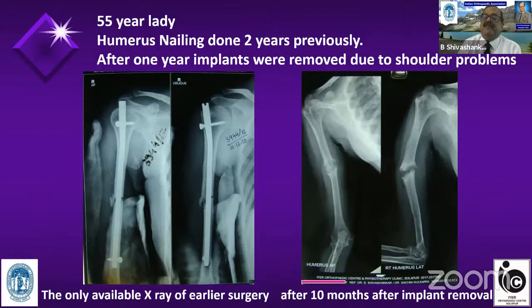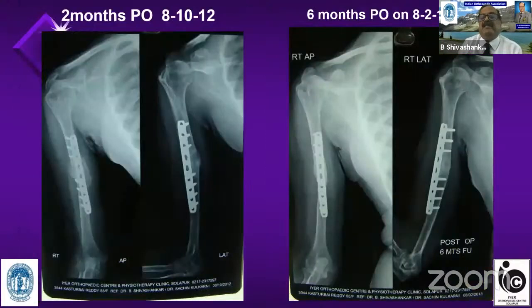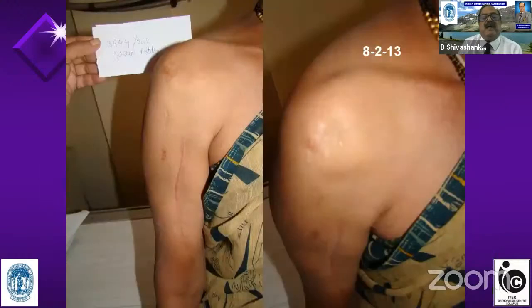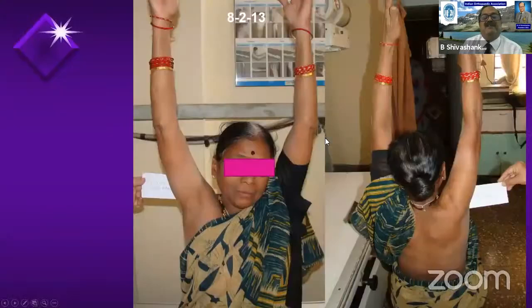Pakka non-union, there was gap, there was a frank mobility at the fracture site. So this case, I treated with a plating and bone grafting. So as I said earlier, I'm not saying that I do only nailing. I also do plating. Within 3 months, the fracture consolidated. And see the clinical picture of the same patient, the entry site of the nail, you can see, which was so proud earlier.